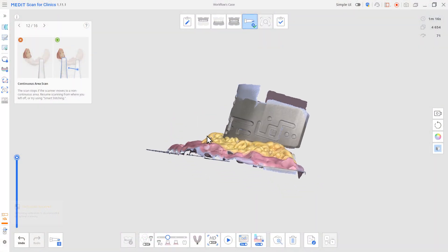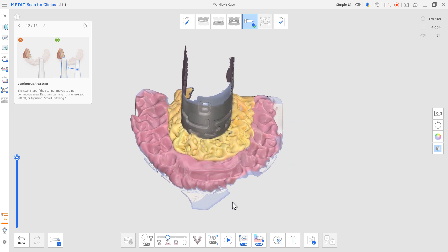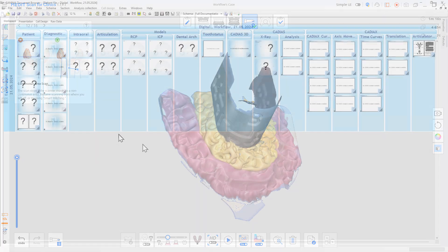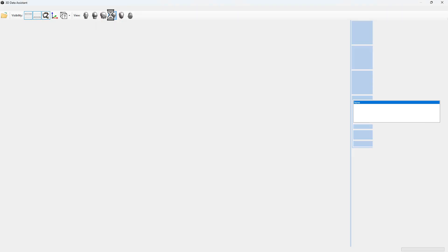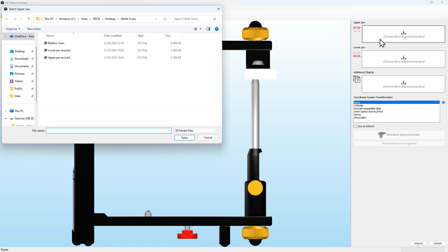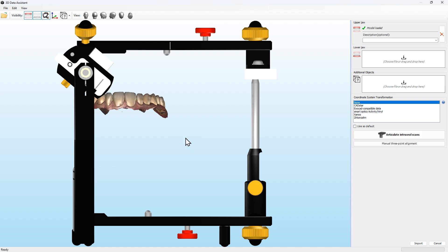Proceed with exporting the scan data from your scan software in an open file format such as PLY, OBJ, or STL. By exporting the scan data, you should have obtained at least three files, which are the upper and lower jaw and interrelation, as well as the scan of the bite fork together with the transfer block.